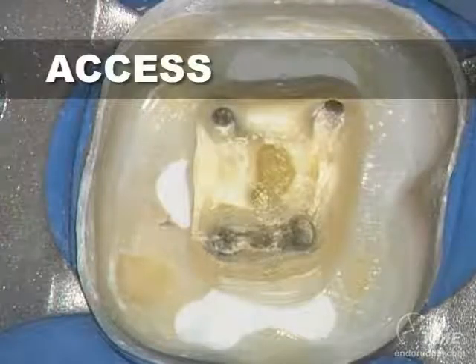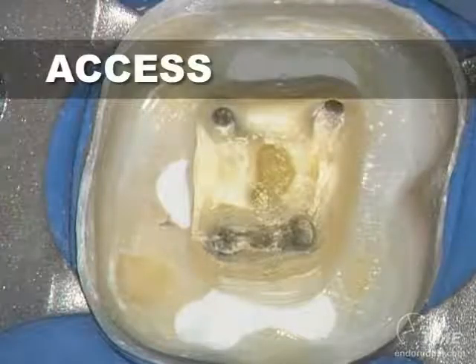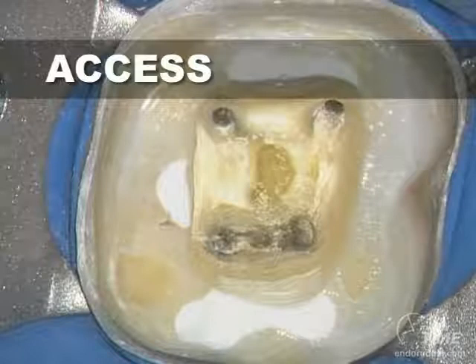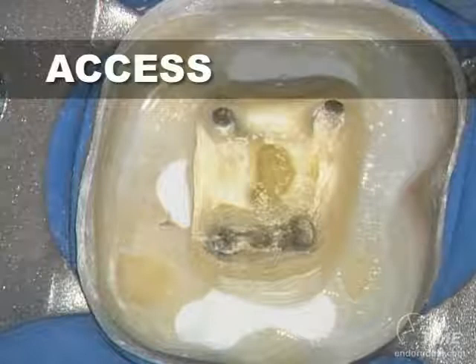Another variable or factor that will influence disinfection is complete access and finding all the orifices.